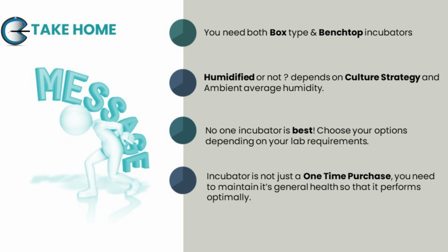Humidified or not humidified completely depends on your culture strategy, the ambient average humidity at the location, and also the fact that needs to be clearly remembered is that humidity will have effect only when you culture without oil and in small droplets for an extended period, and the effect of humidity will be more pronounced only when you have a box incubator. The effect of humidity is less pronounced when you have a benchtop incubator.